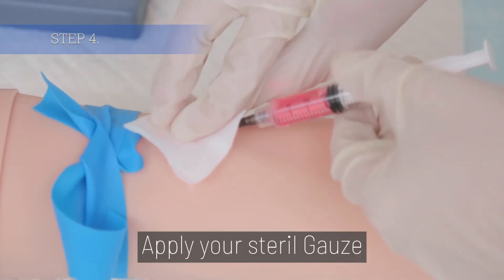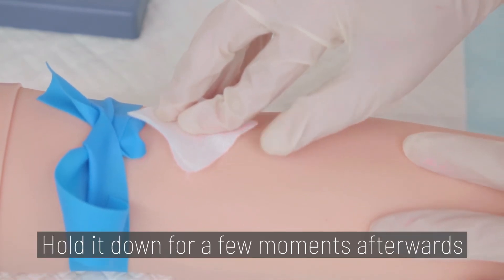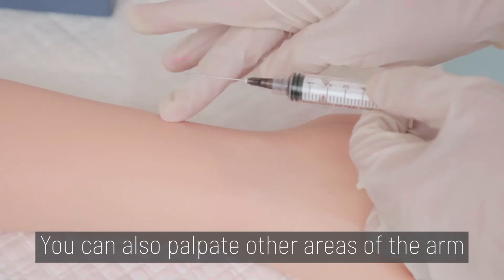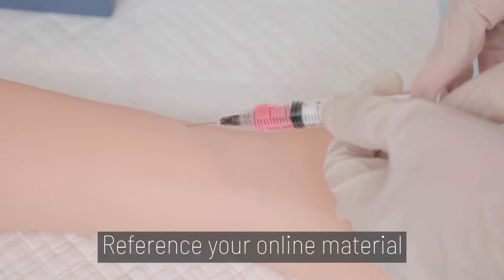Step 4. Apply your sterile gauze to the needle insertion point and gently apply pressure as you withdraw the needle. Hold it down for a few moments afterwards to stop the bleeding. You can also palpate other areas of the arm and draw blood from those sources. Reference your online material for additional learning.